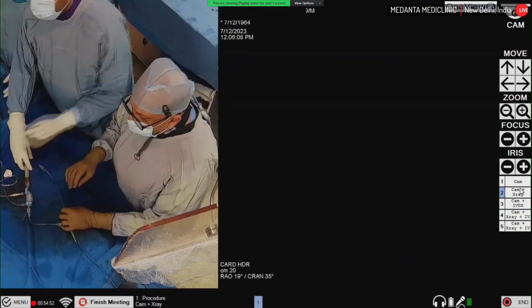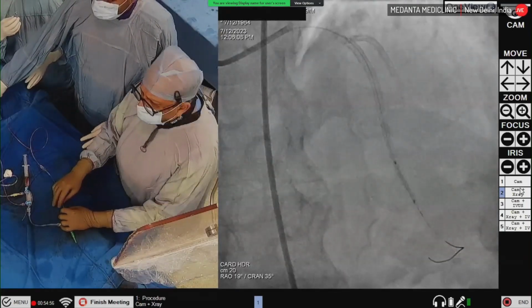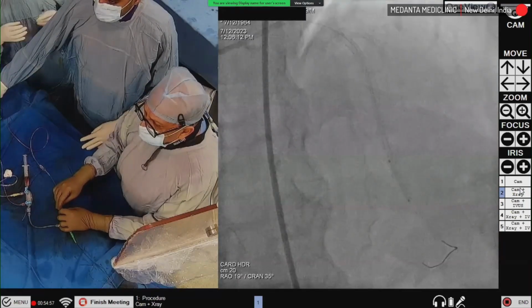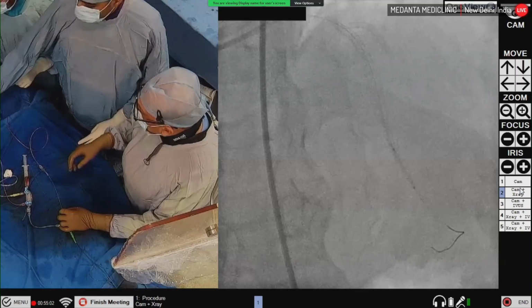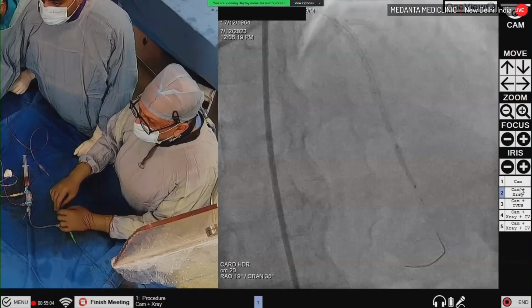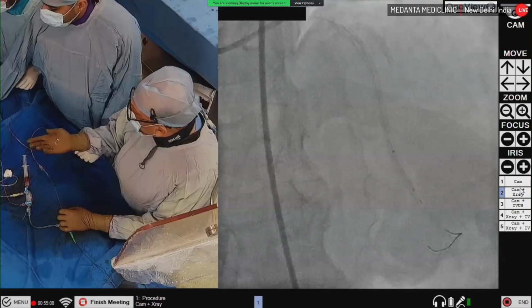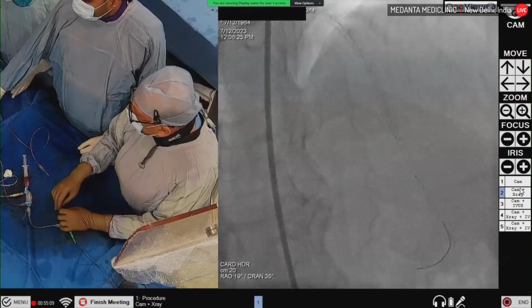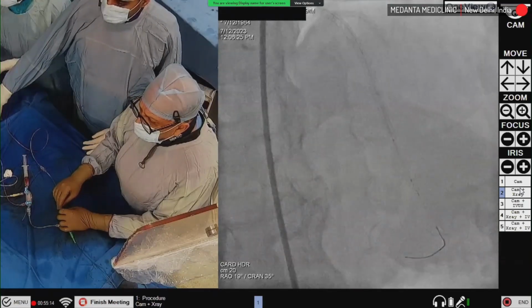Okay. 1, 2, 3, 4, 5, 6, 7, 8, 9, 10, 12, 14, 16. At 16, how much is the size now of the Wolverine? Wolverine goes up to 2.5. Deflate, about 2.4 or something like that. Okay, 2.25. So what are the choices we have?